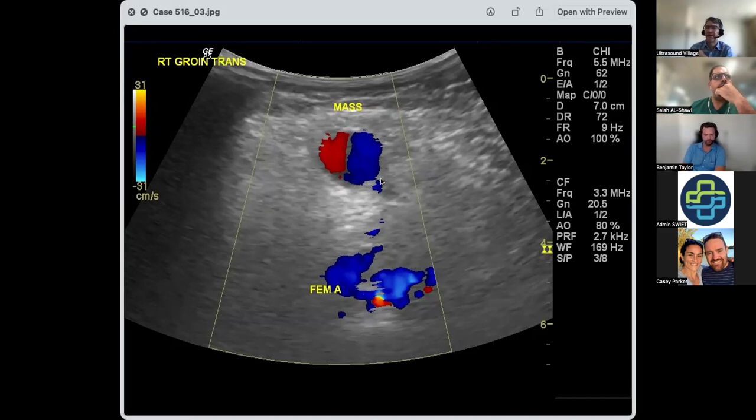So the ones that had a narrow, long neck were very suitable, but one with a short, wide neck is much more problematic in terms of using thrombin. If you needed to surgically tie this off, you've got a lot of space to do it, whereas if it came straight off the artery, it's much more difficult. So they'll often stent these sorts of pseudoaneurysms.